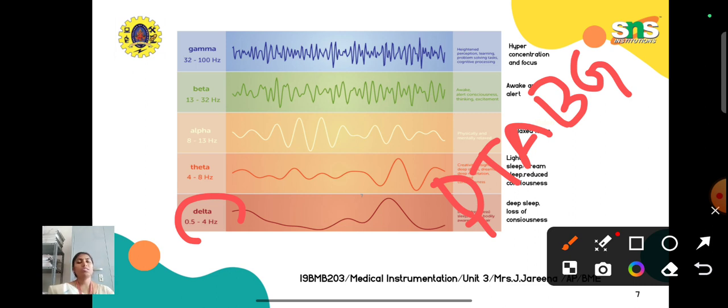From these waveforms itself, you come to know the status of the brain, the mental state of the particular person. You also get to know whether they are in a depressed state, anxious, happy, or not feeling good about something. You can even read the mental state of those people. In that way, EEG is also helpful for understanding the mental health of people.